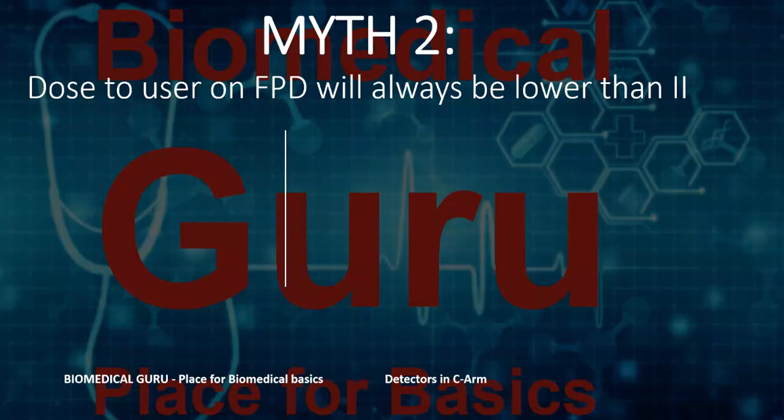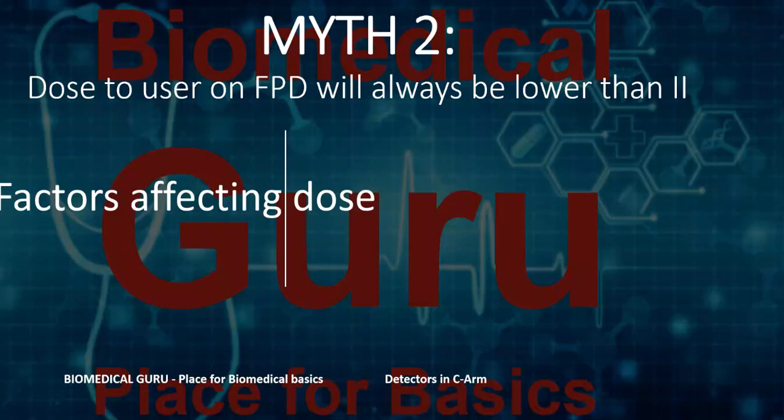And another myth that is typically seen is about factors affecting the dose. Generally, we think that flat panel detectors are always dose effective, but it's not the case. The DQE, which is the detective quantum efficiency of the detector at the specific EAK, which is entrance air kerma, will affect the dose.